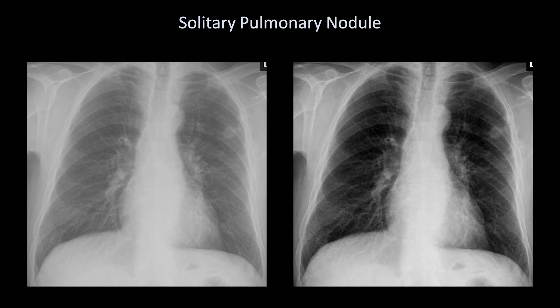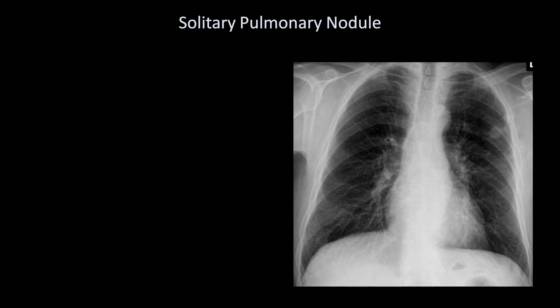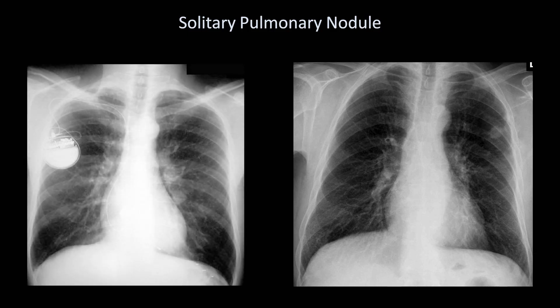An important aspect of identifying a pulmonary nodule is using the correct amount of contrast. Consider these two identical films — the nodule is slightly easier to see when contrast is increased. In another example, a nodule of approximately the same size and round shape is much harder to spot due to its central location near the hilum.